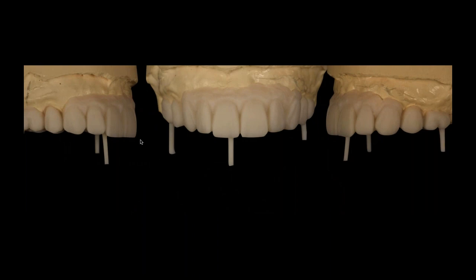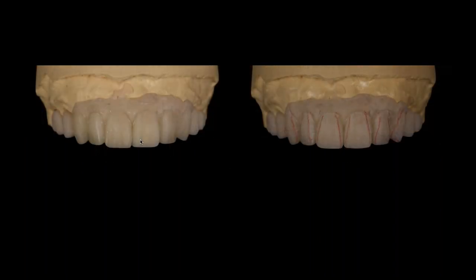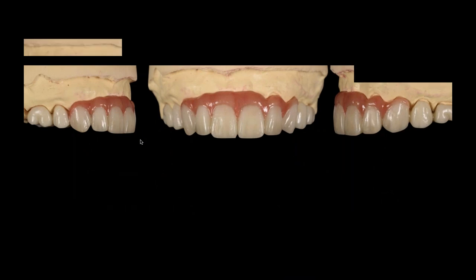And we're not doing very well with the pink we have, especially since we're probably going to be putting these implants to sleep at this point. So the provisional is made. One little management trick here is whenever I make provisionals with pink, this might sound a little funny, but it's true. I don't want the pink to match. I really don't want the pink in provisional world to match for us.